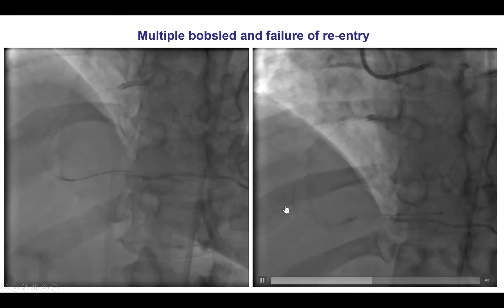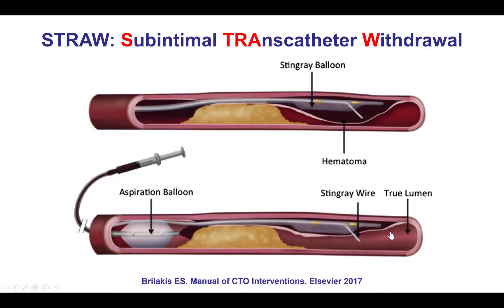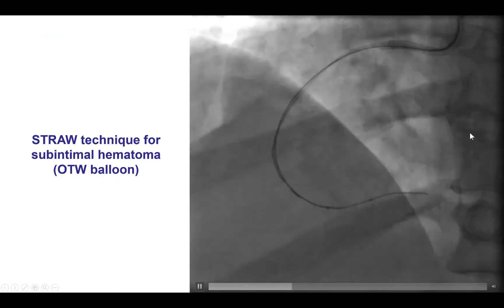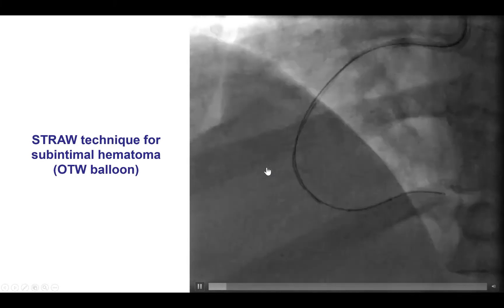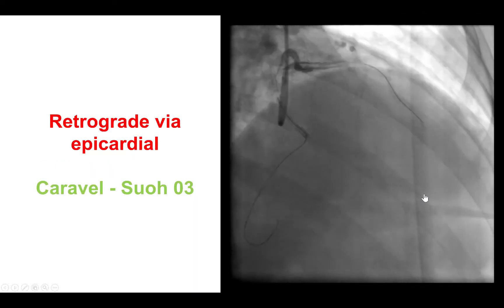This part of the vessel, which previously appeared fairly large caliber, was now almost completely obliterated, likely because of subintimal hematoma formation. In cases like this, the STRAW technique — subintimal transcatheter withdrawal — can be used to aspirate the hematoma and decompress the compressed distal true lumen. This can be done by aspirating from the Stingray balloon directly, or by advancing an over-the-wire balloon or guide catheter extension and aspirating from that. We advanced an over-the-wire balloon and aspirated through both the over-the-wire balloon and the Stingray balloon, but were still unable to re-enter.